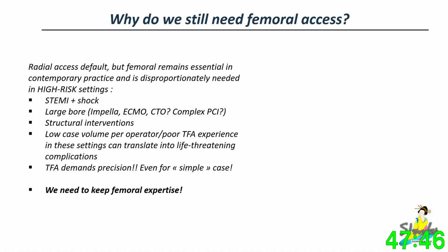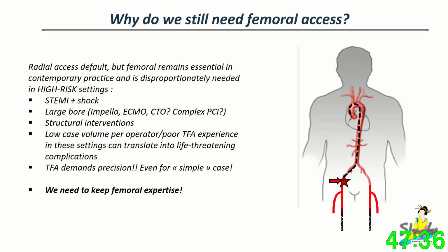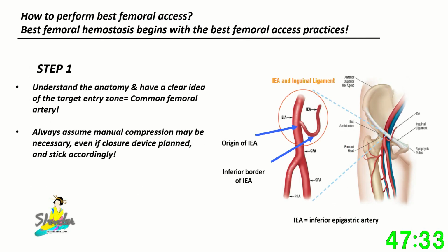So transfemoral access demands precision, even for a simple case. So in other words, we need to keep expertise in femoral access. So how to perform best femoral access? It always begins with the best access for femoral practice. So the first step is to understand the anatomy and have a clear idea of the target entry zone, which is the common femoral artery. And this is very simple.